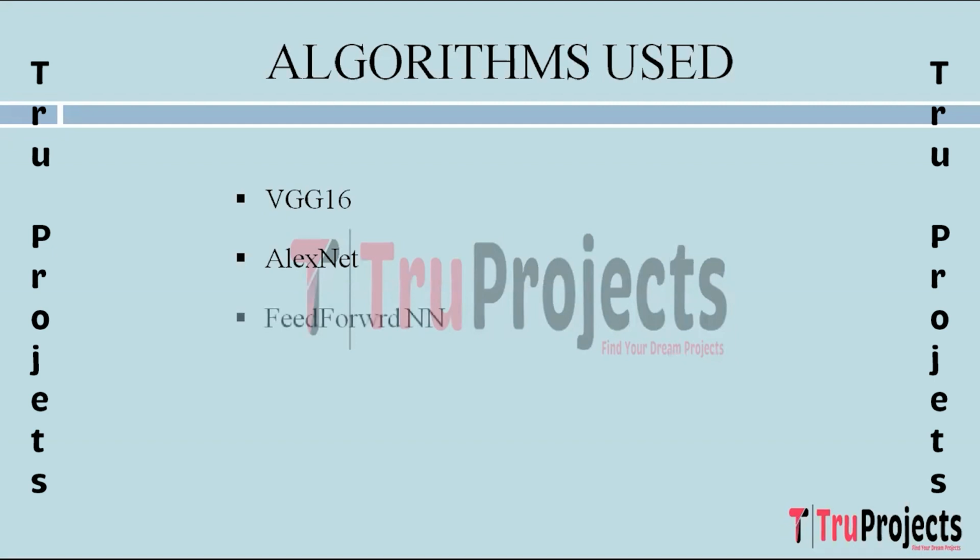disease. The next one is feed forward NN. So, a feed forward neural network, the simplest form of artificial neural networks, consists of input, hidden, and output layers. Information travels unidirectionally from input to output. Though not as deep as CNNs, feed forward NNs are versatile for various tasks. In this project, they serve as a baseline model for comparison with more complex architectures.